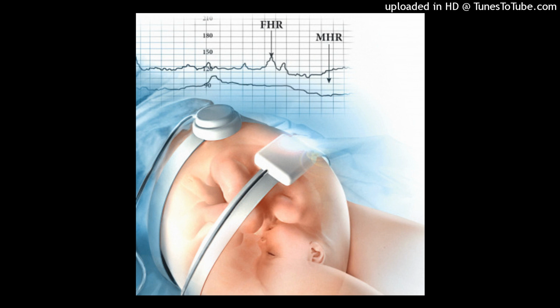Normal: 5 or fewer contractions in 10 minutes, averaged over a 30-minute period. Tachysystole: more than 5 contractions in 10 minutes, averaged over a 30-minute period, regardless of whether periodic or episodic changes of the FHR are present. Terminology such as hyperstimulation or hypercontractility is no longer accepted.